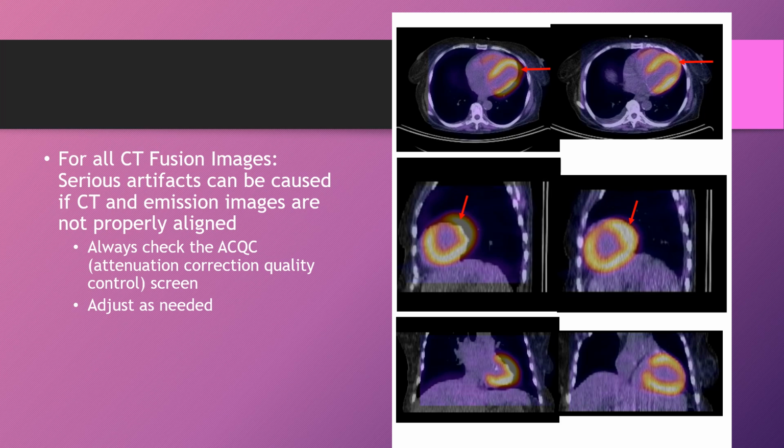So if you're ever not sure if that's what's causing it, you can look at the non-attenuated correction PET images to see if the defect is still there. And you should always review this ACQC page to see if that alignment issue is occurring.